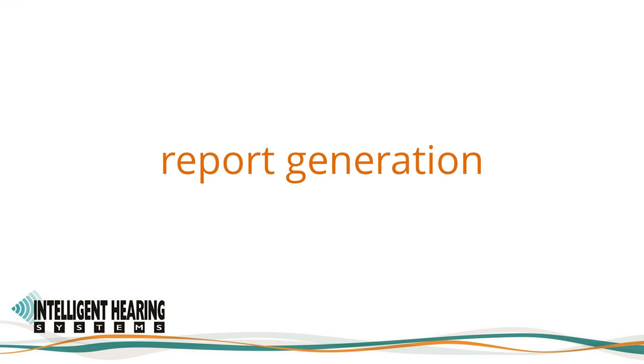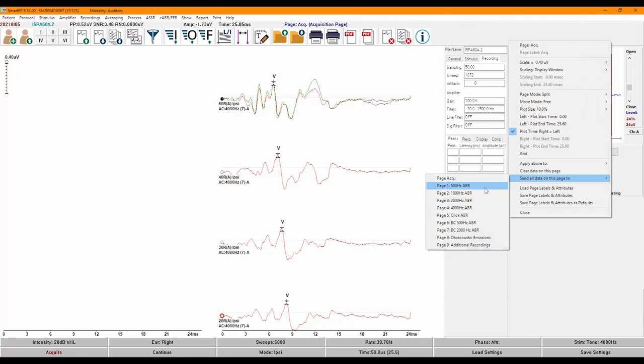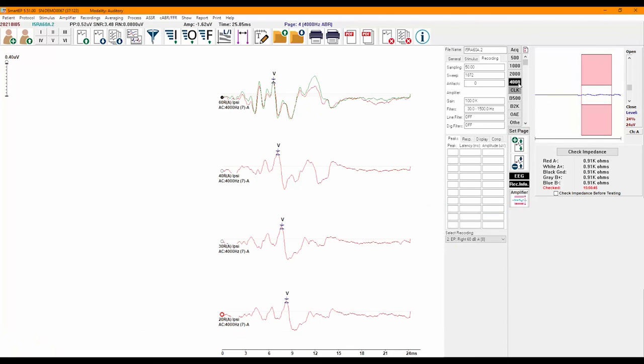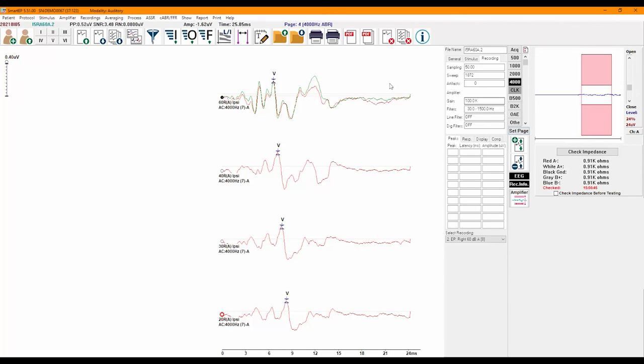We have already covered many of the report generation features during the acquisition section, since many of them can be used while you're acquiring. One other feature that was implemented is the ability to set up page attributes for our pages and save them. This is useful if you use page labels, as you can save page attributes including the time and amplitude scales, zoom size, and all the parameters you see when you right-click on a page as part of your default or specific attributes. This only needs to be set up once at setup.